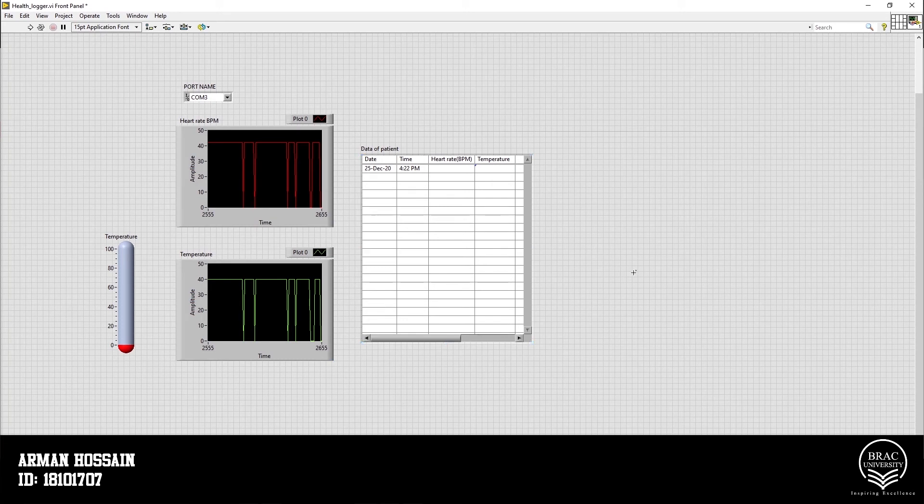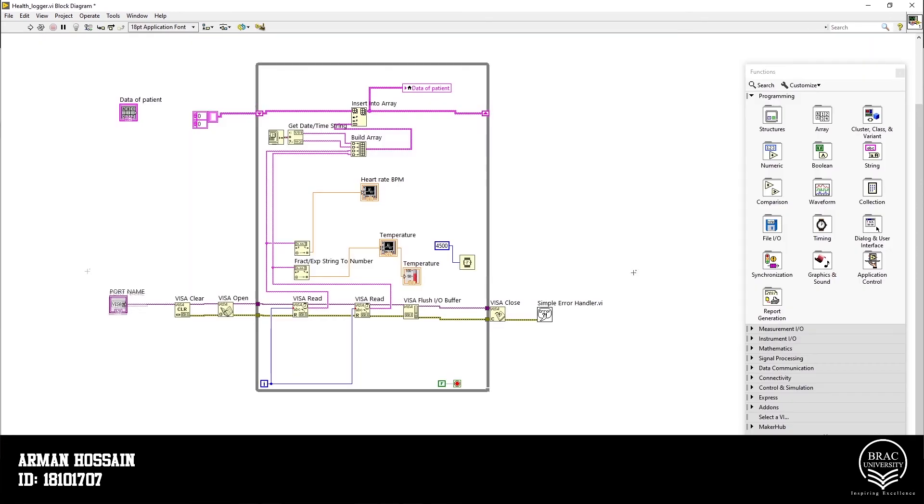Now let's look into the block diagram part of our project. Here we have VISA board. It will get data from Proteus COM board. Then it will be read by these two VISA reads. Since we are fetching two data from our Proteus, we are using two VISA reads.